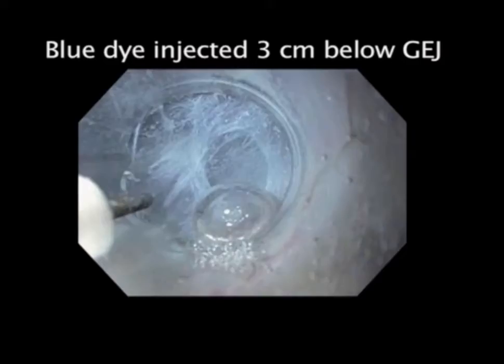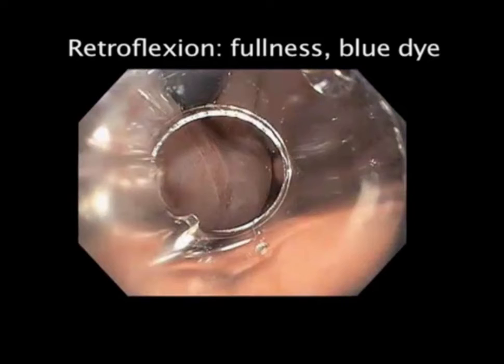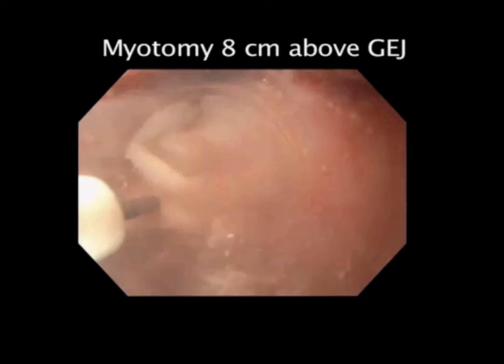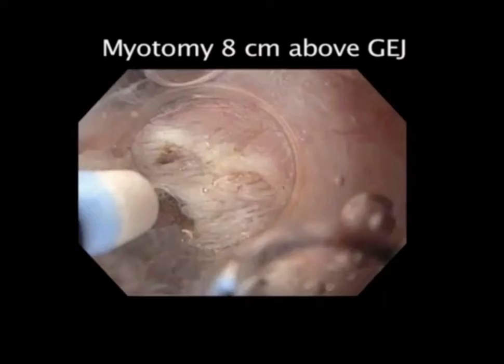We remove the endoscope, switch on the gas again, go down into the stomach into retroflexion, and you can see fullness and blue dye discoloration, confirming that we entered into the cardia. Now we're ready to start our underwater myotomy, eight centimeters above the GE junction. The gas has been switched off and we're going to cut the circular muscle layer. This can be quite thick, so we have to do this layer-wise — it's like peeling an onion.